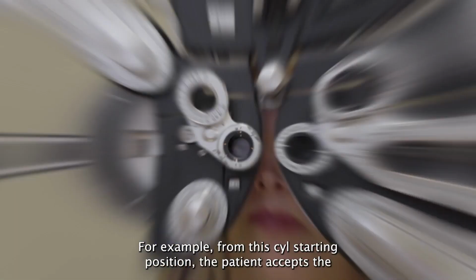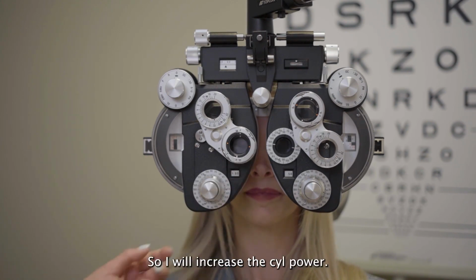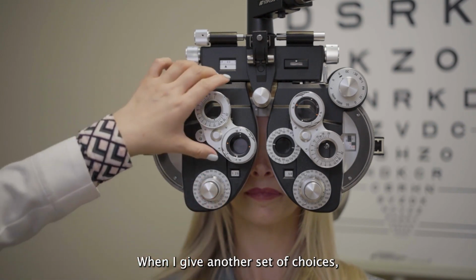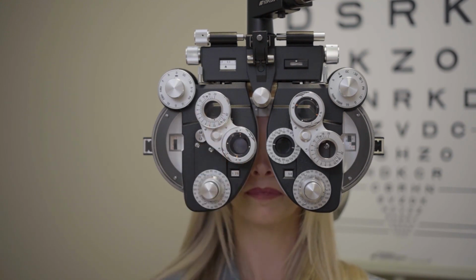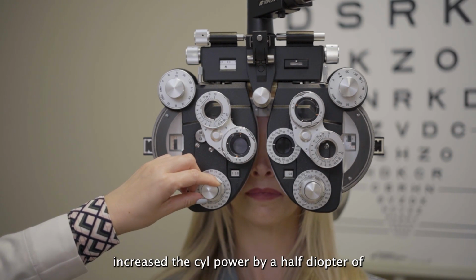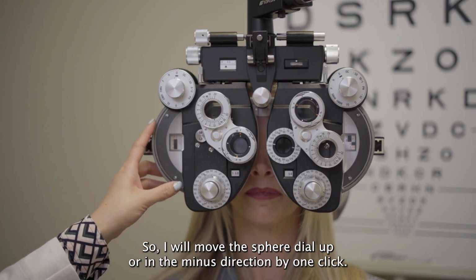For example, from this cyl starting position, the patient accepts the white dot choice, so I will increase the cyl power. When I give another set of choices, again, the patient accepts the white dot choice. So when I increase the power again, I have increased the cyl power by a half diopter of plus power from my starting point. So I will move the sphere dial up, or in the minus direction, by 1 click.